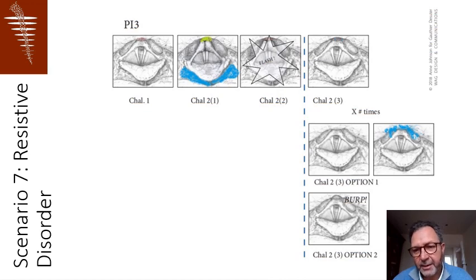Boerke in het Nederlands. These are signs of resistance there. So there is something on the UES that is not normal. Even if you can't see the UES, you can infer this information quite precisely. The most known disease that presents this feature is the Zenker disease. So the patient is able to clear his pharynx, but then after a while there is some regurgitation, and this is of course also a disease of the UES.